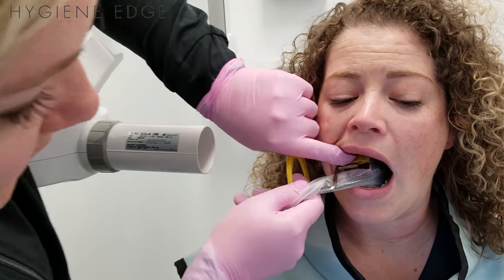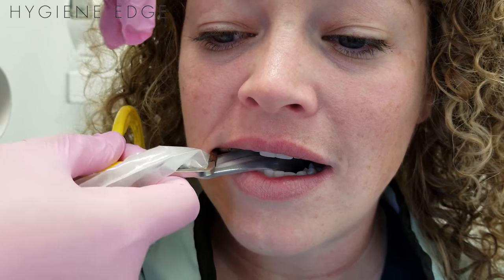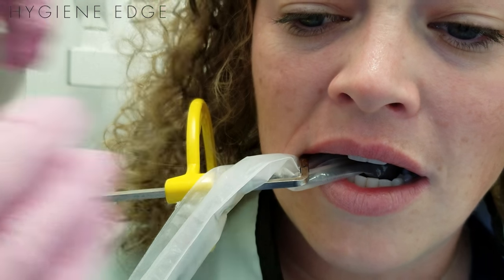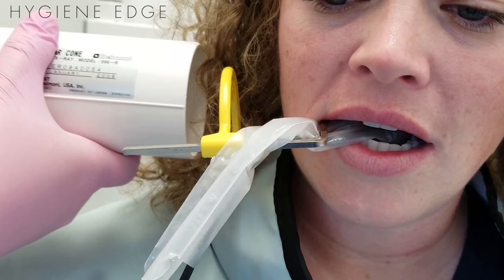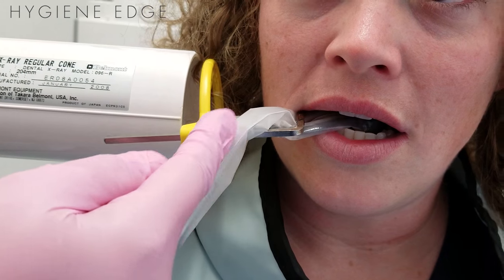If you put pressure where you want it, go ahead and bite. The film or the sensor is less likely to go this way. Sometimes it does kind of float forward a bit, but kind of like with your bite wing, line up your tube head to the sensor and not the ring.